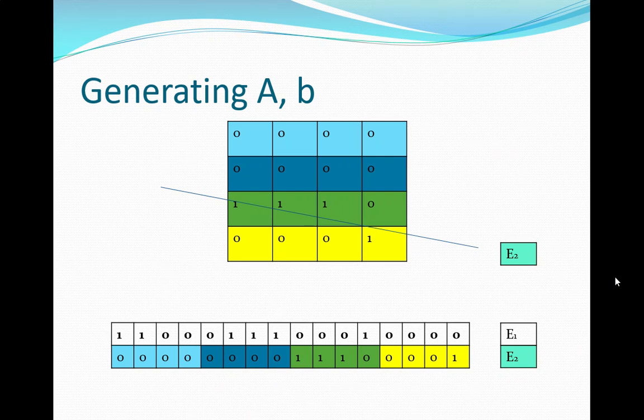Yes, so when we do this for real, are we going to have to have the top box be 3-dimensional? So we do slices. Yes, it is 3-dimensional. But typically the distance between slices is bigger than what you have here. So if this is a millimeter on a side, between slices, and this is true for x-rays and MRIs, it's typically 1.5 to 2.5.